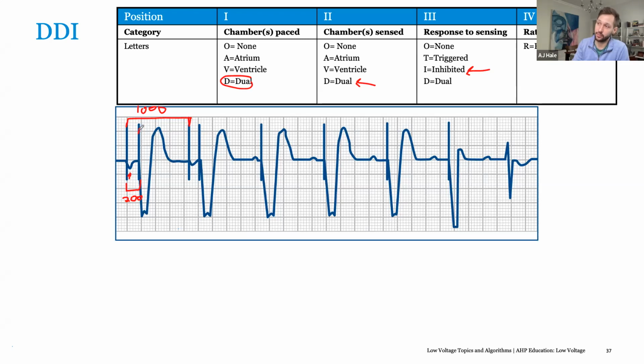So our ventricular paced event occurs, and it has then subtracted 200 milliseconds from what your ventricular based timing was, which is 1000 milliseconds. It subtracts 200. I'm left-handed and I'm using my right hand, so if this looks terrible, that's why. Subtracts 200. So your actual A to A timing is based on your V to A timing of 800 milliseconds after the ventricular event occurs.